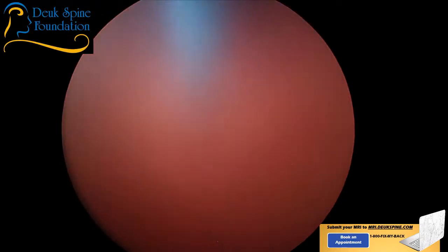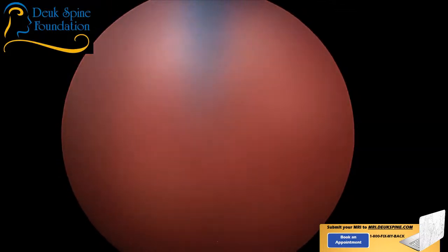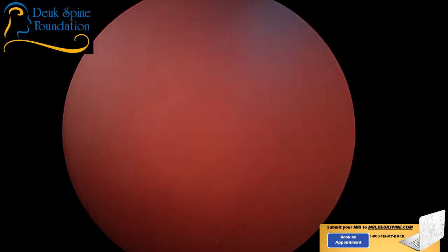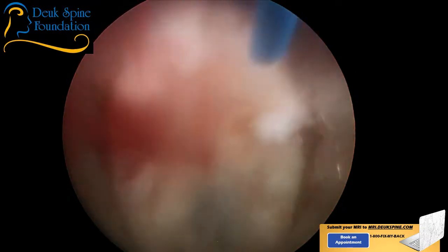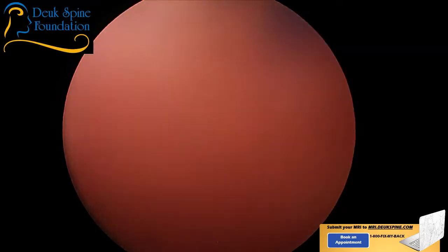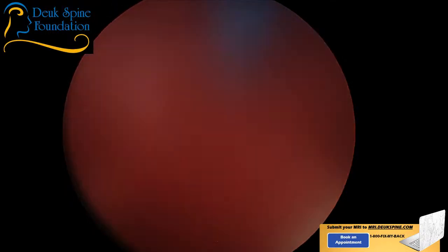It's called Omnipaque. Isn't that what we're using? Luis, Omnipaque? Omnipaque, yes. Indigo carmine, yeah. And the Omnipaque basically is pretty standard X-ray dye. It allows us to see on the X-ray picture the center of the disc and the tear. And if you go back and rewind, you'll be able to see where the black dye on the X-ray picture was leaking out through tears in the disc. Those are annular tears, okay? And that's what we're here to fix and debride, especially the one where the herniation came out of, in the back of the disc. It's called the posterolateral annular tear.